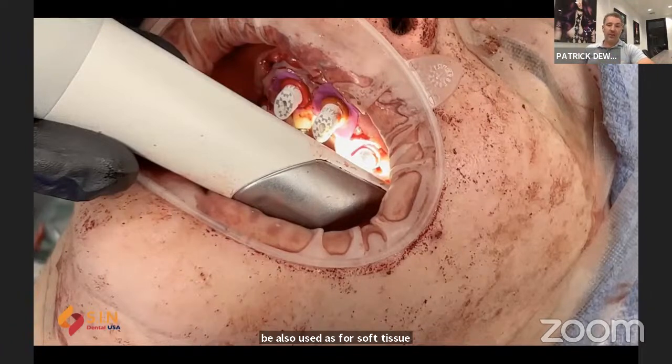there's 2 or 3 other cameras out there that are also under the photogrammetry brand. There's iCam 4D, there's PIC, and there's one out of Europe called OXO. Now, the OXO has not really hit the market yet. PIC is pretty much dried up in the US. It just hasn't been a mainstay product that has the big hockey puck flags that can be very difficult to deal with in the mouth.